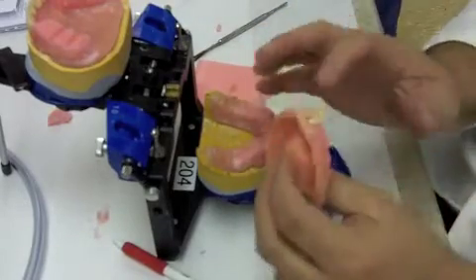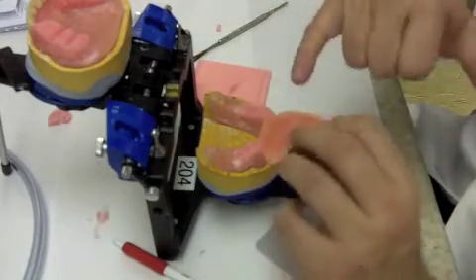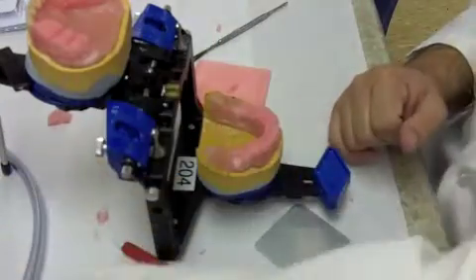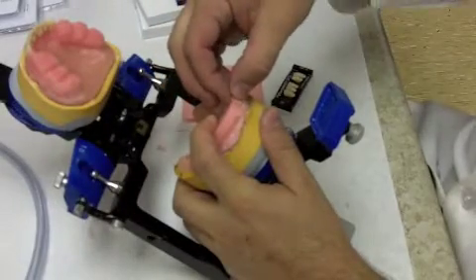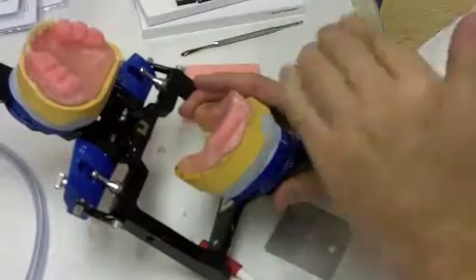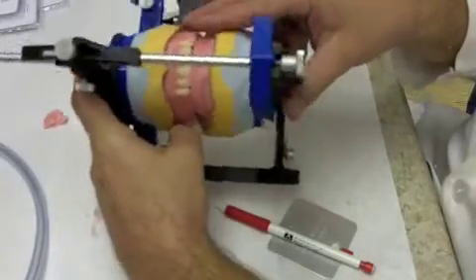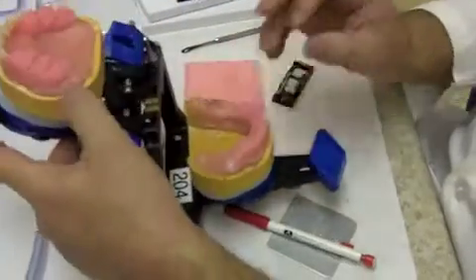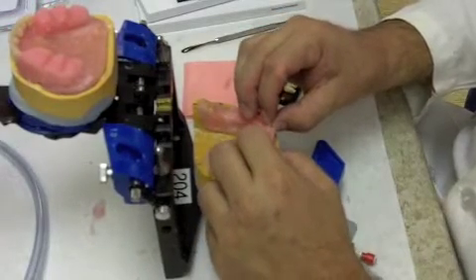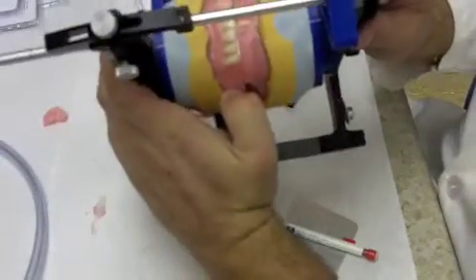From the inside of the setup you don't see any hole or void in the denture — it's finished with wax — but that allows us to move the teeth further towards the cast if needed. We don't want to do too much adjusting of the teeth to get them into position because sometimes we prematurely make the teeth too short. For this simulated patient we're looking for about one to two millimeters of vertical overlap and one to two millimeters of horizontal overlap. We do not want any anterior teeth contacting. If they were slightly touching, we need to move the tooth slightly lingual.